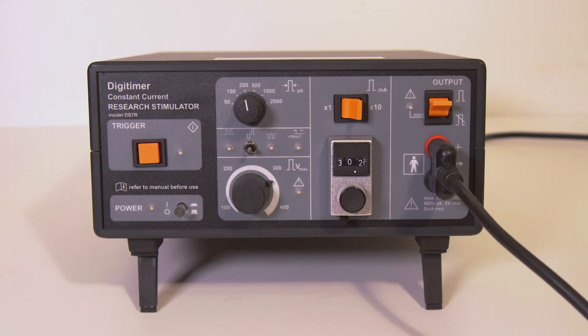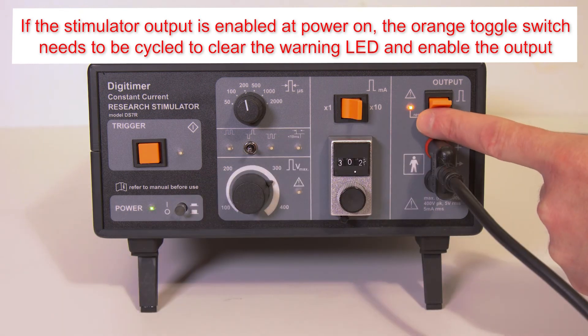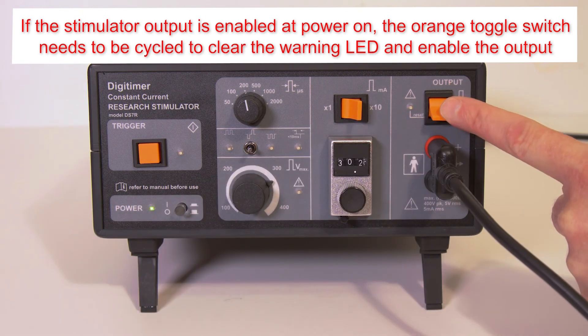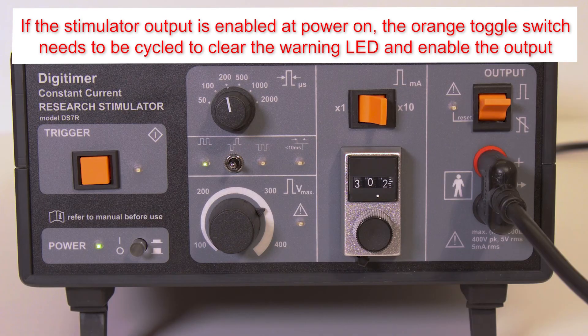If the DS7R is powered on while the output toggle switch is enabled, the error LED illuminates and will remain lit until the toggle switch is disabled. This action resets the warning and enables the output.